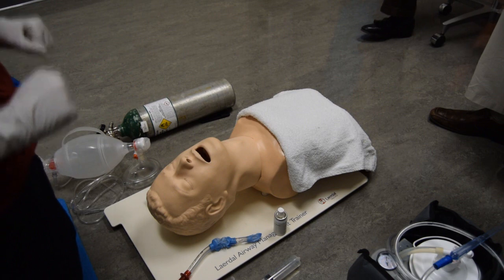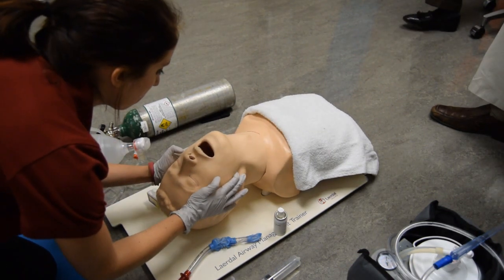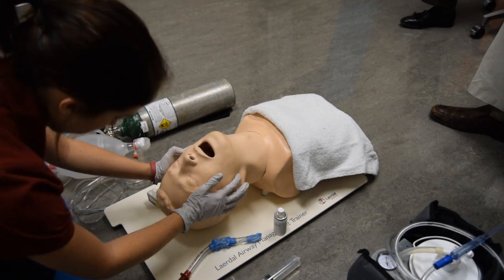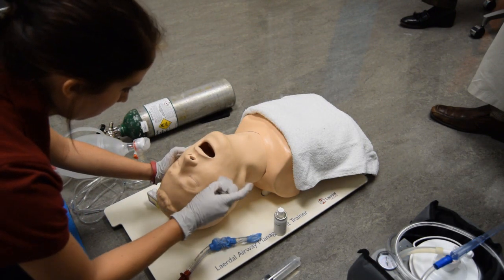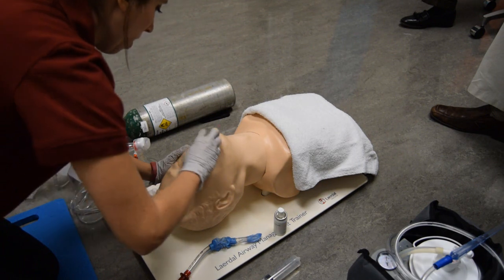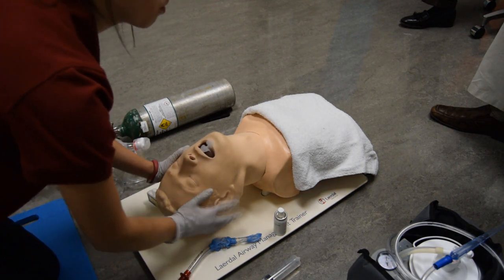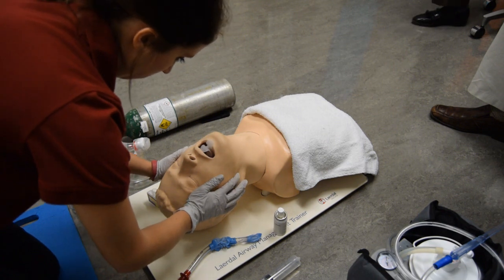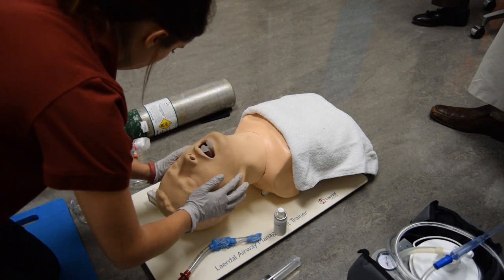Opens the airway manually. Elevates tongue and inserts simple adjunct. Examiner now informs the candidate: no gag reflex is present and patient accepts the adjunct.